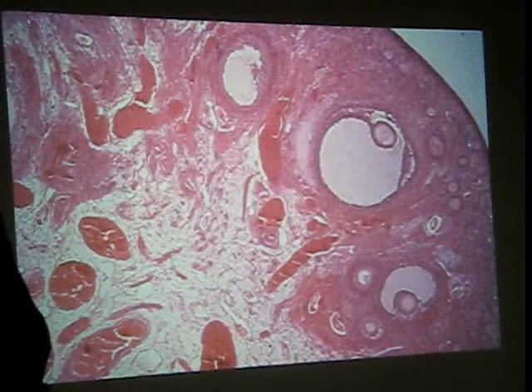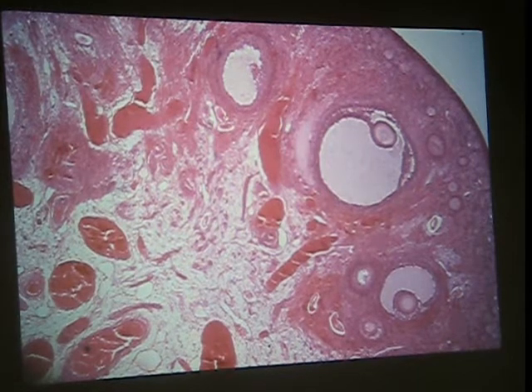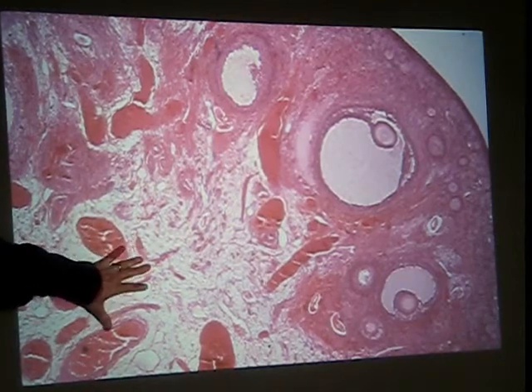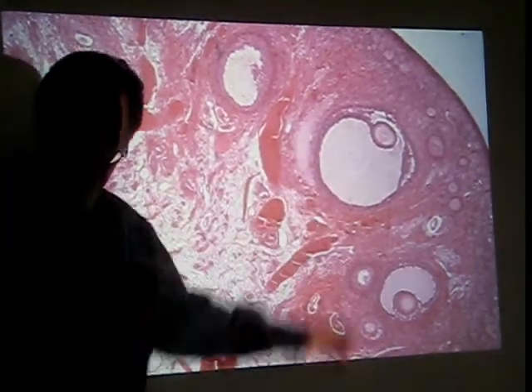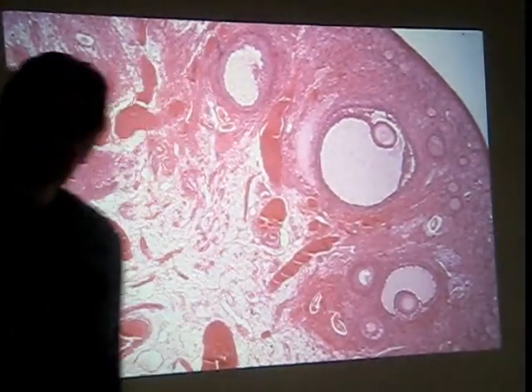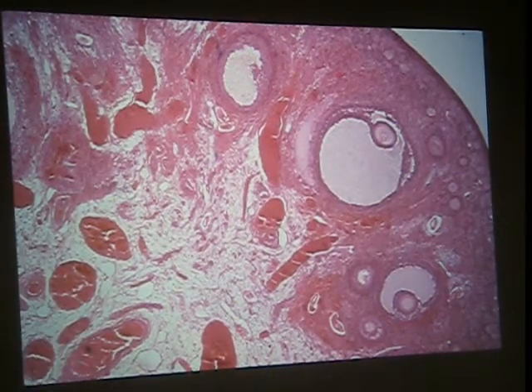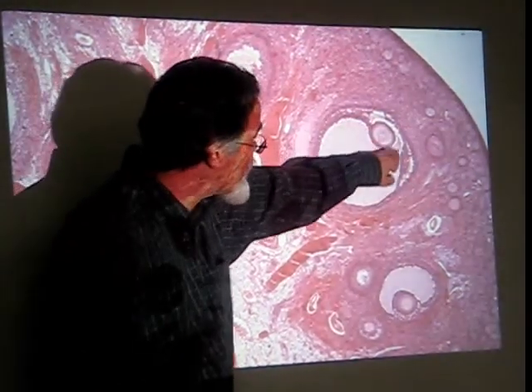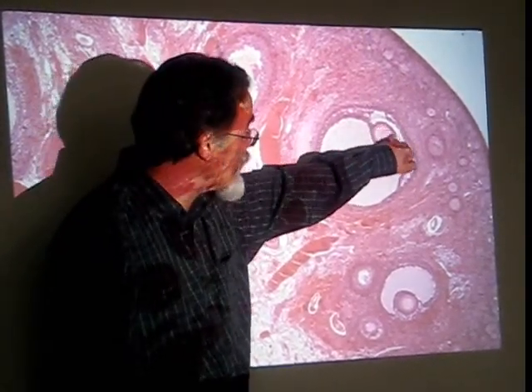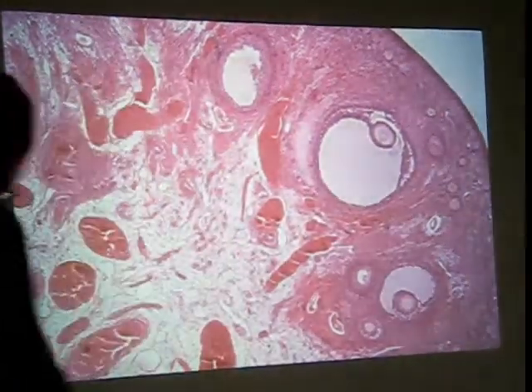Okay, this brings us up to female repro. So, clearly the ovary, right? You can see in this shot, quite nicely, the blood vessel-filled medullary region and the follicle-filled cortical region. These would be what kind of follicle? Because they have what? An antrum. You can see the oocyte here, this would be the cumulus oophorus, right? And you can pick out the zona pellucida. And out here we've got primary and primordial follicles.